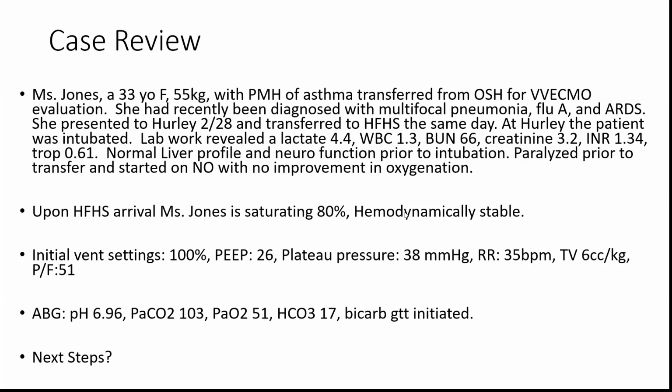Collect both, okay. I think that's a fair and safe response. And actually, it's a great response, right? Because one of the things I mentioned historically was that they were starting ECMO too late, when patients were too far down the line. So one of the things we want to educate you all on is that when you see this patient, you're calling the ECMO care team. Whether they're cannulated right then or not, they should be called to at least do an evaluation and decide if the patient's a candidate. What else are you able to do?